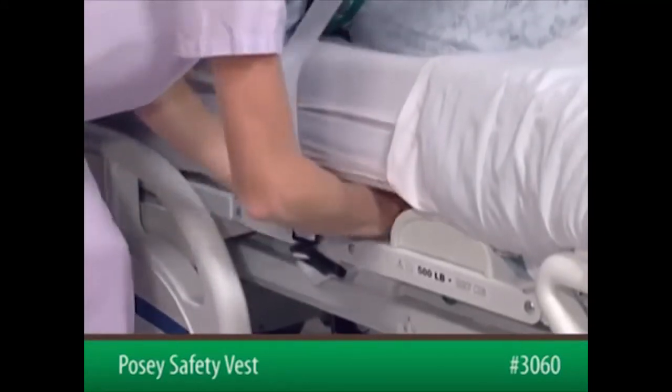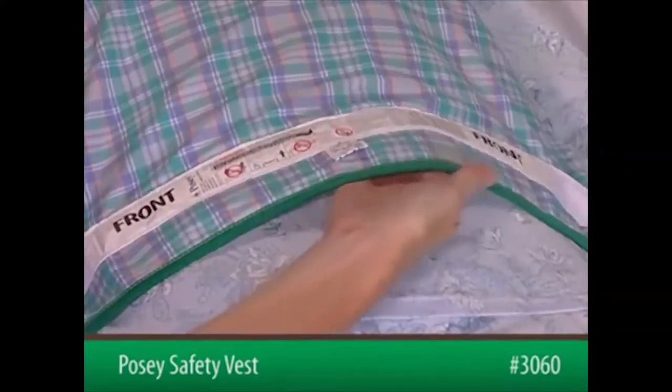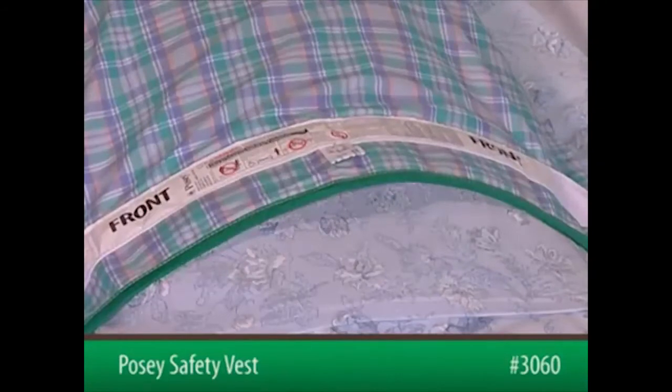After securing both sides to the bed frame, slide an open hand, flat, between the device and the patient to ensure proper fit. The device must be snug but not interfere with breathing.